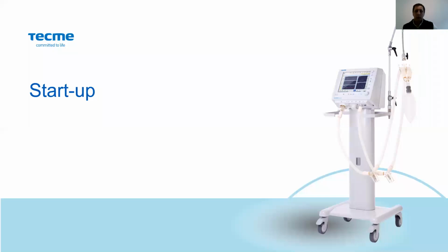So most of the people reply properly in two questions. This, let's say, a little bit easy. The proper reply is that with the GraphNet Neo, we are going to be able to ventilate infants and neonates.